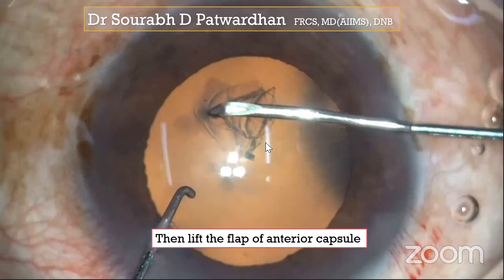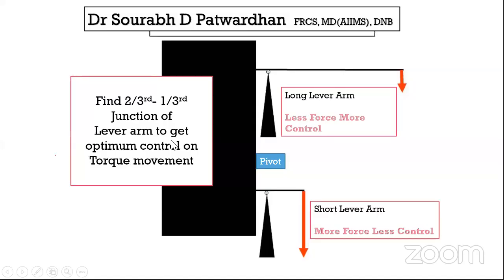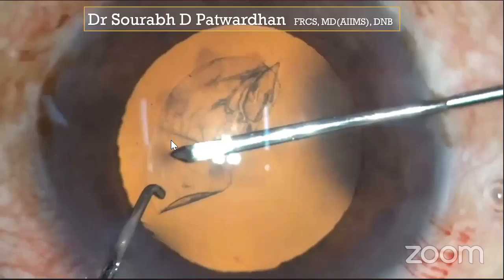So let's start. Okay, so this is one concept that I try to explain to my students, and I will actually show it on the capsulorhexis edge. From where you have torn the capsule, that you can consider as the pivot, and where you are going to hold the flap can be considered as the lever arm.